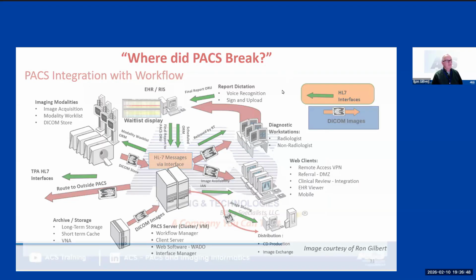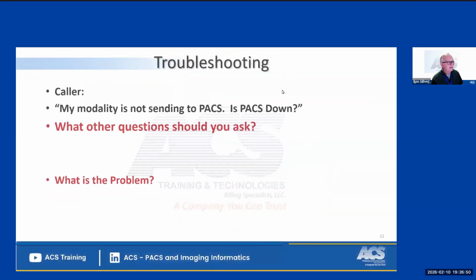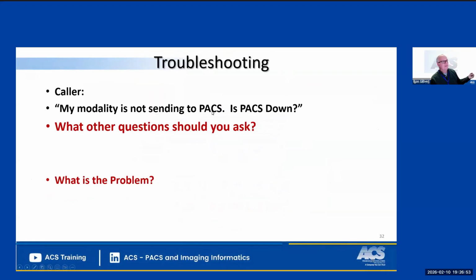So, troubleshooting, this is an example of some of the live exercises we'll do. So I could say my modality is not sending to PACS, is PACS down? Well, what questions should you ask? First of all, did the modality fail sending to PACS, or did it say sent? Because that means it went into the PACS somewhere, it's just probably misidentified. So PACS is not down, but also other questions, is anyone else having trouble with PACS? Is it just that one modality, or is it everybody? So that's when you have to go and define the problem. So this is kind of how we have these interactive discussions and learn this.